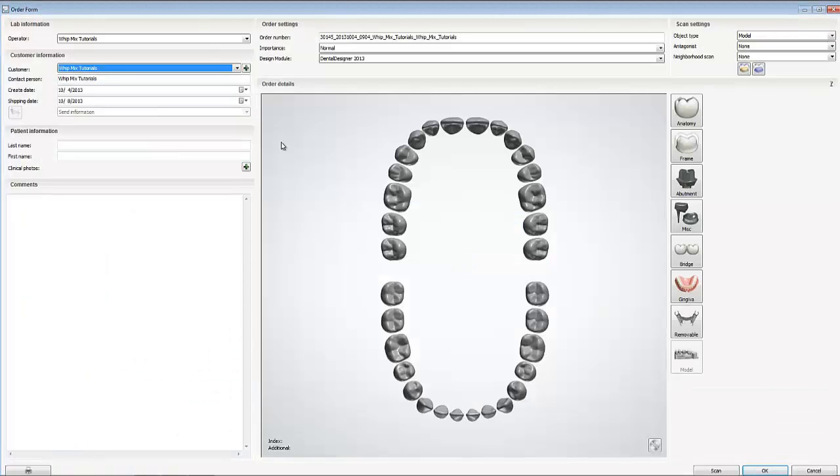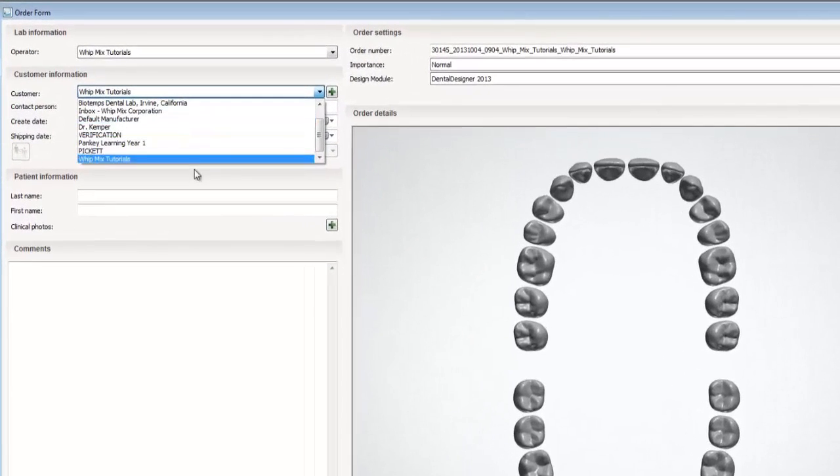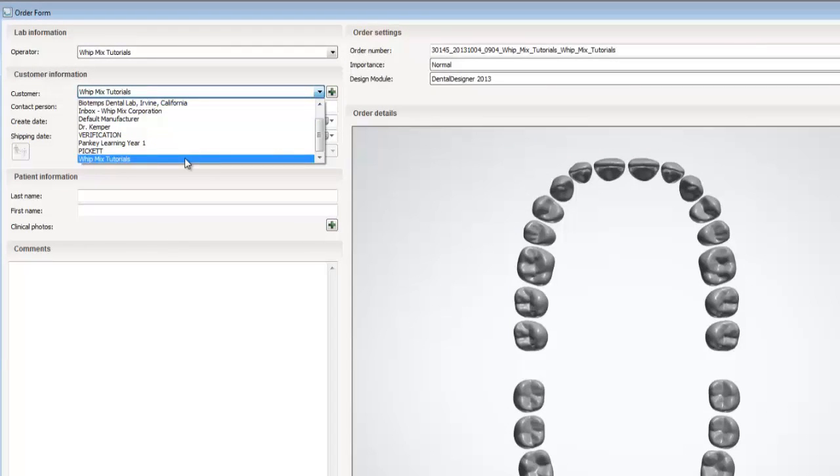The order form will reload shortly after pressing save. Once it loads, we will want to click the drop down caret next to customer. This will bring up the list of all the customers on your system. Now we want to select the customer we just added.